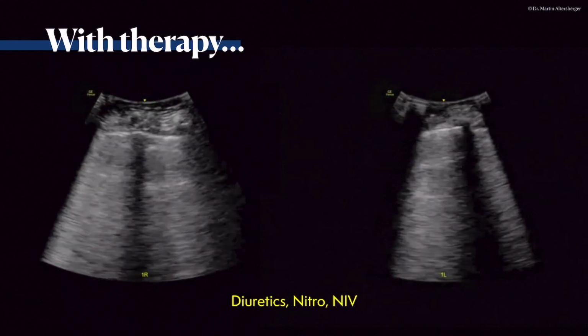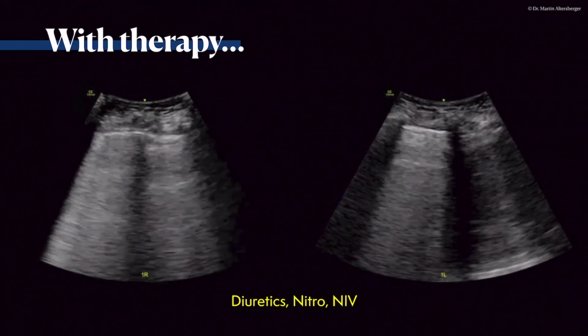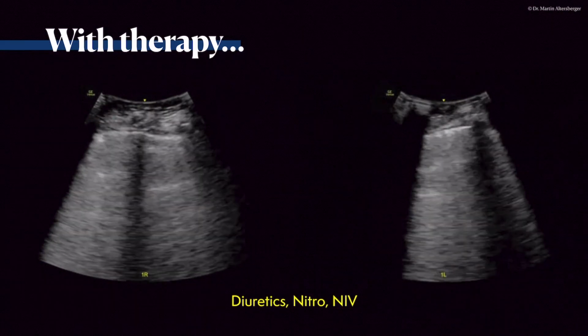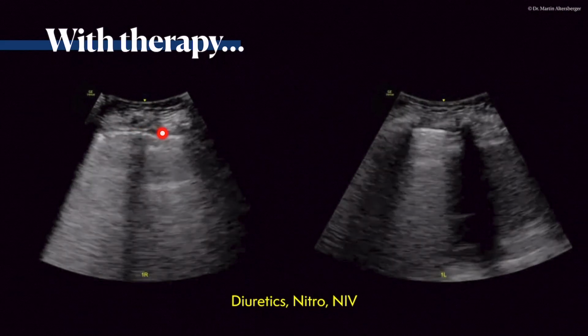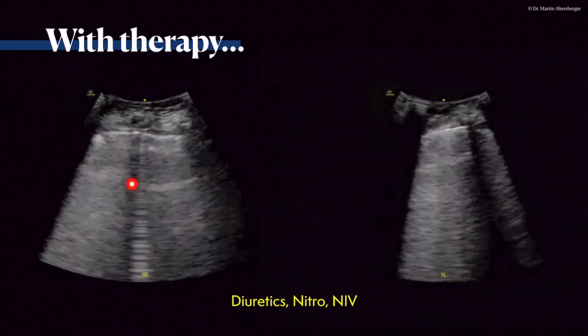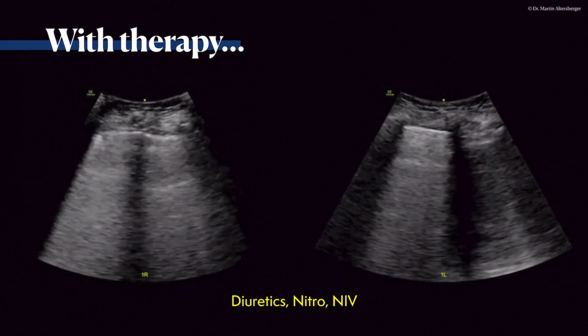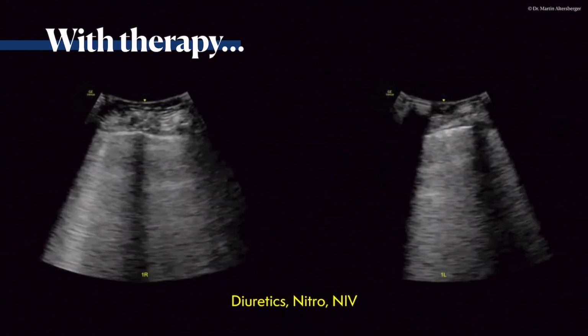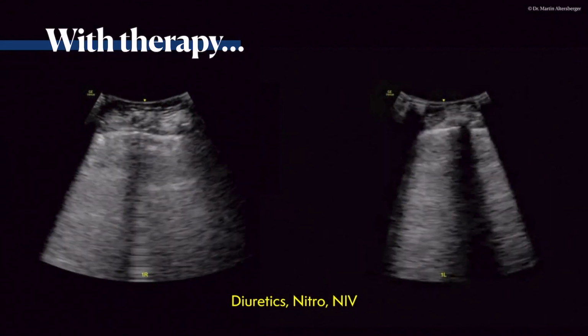And it responds very nicely to therapy, so with diuretics, nitroglycerin, and CPAP, so non-invasive ventilation. Very quickly you do see that this is the pleural line. There are still some artifacts present, but you see other artifacts as well, so-called A-lines, the mirror artifacts of the pleural line, indicating that there is less free lung water present.